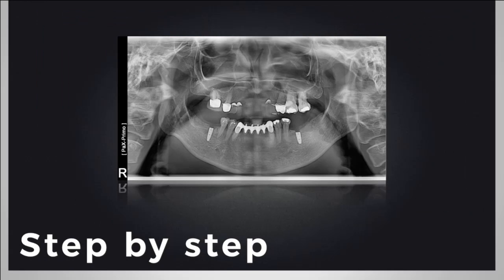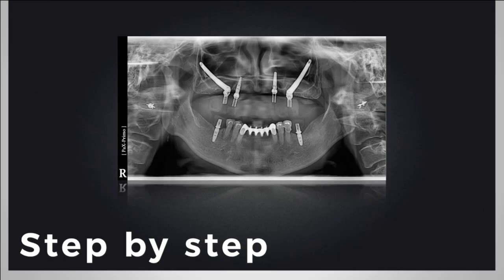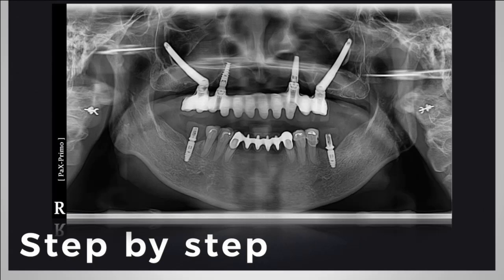So that's going through the process with the immediate. That's the immediate caries removal and pathology removal stage. Those are the zygomatic implants in place. That's at a bite review stage. That again is a provisional restoration at review, and that's the final restoration in place.